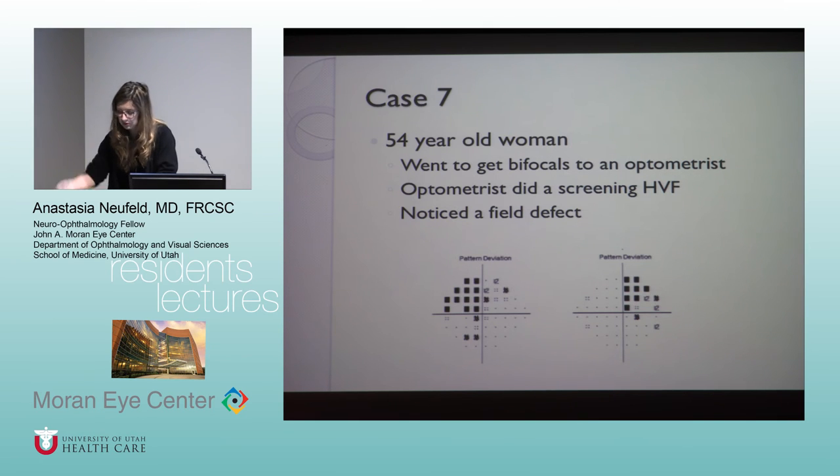So you can just generally yell out what you think this is. Yeah, so this is a bitemporal visual field deficit. And yes, there are a few lesions here, but again, the flavor is that it does respect the vertical midline, so you really have to think back. Which portion of the superior versus inferior visual field is located where? Is it inferior or superior?